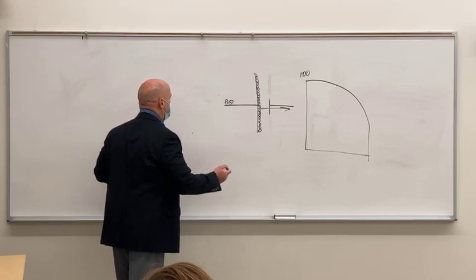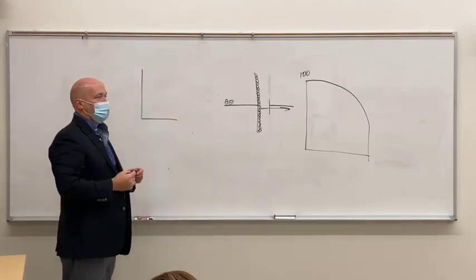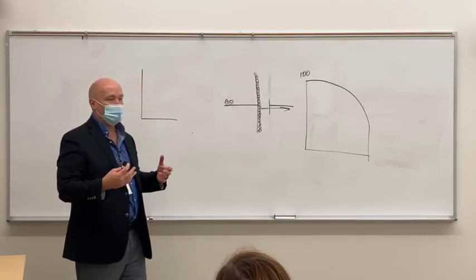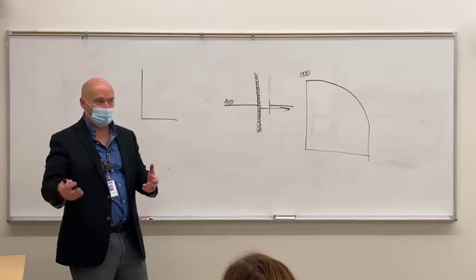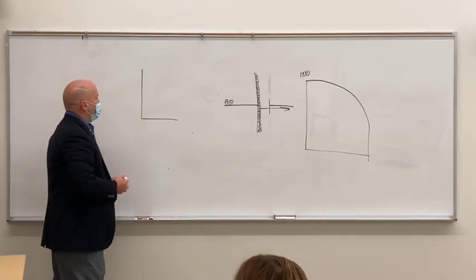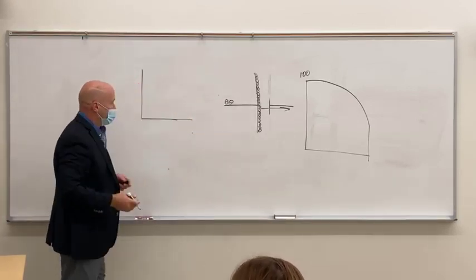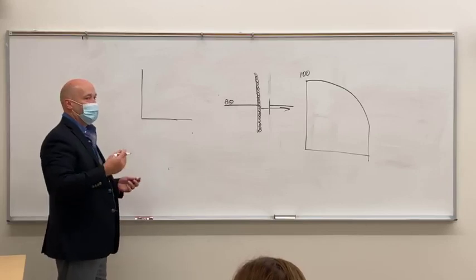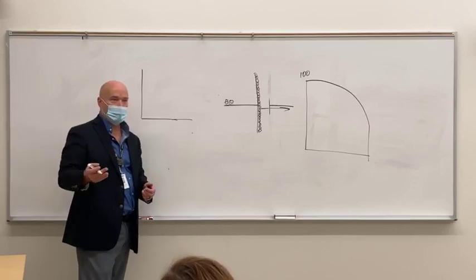What happens on a falling load generator is that they are designed, and I think they were originally implemented in departments that needed rapid exposures, very rapid exposures. But what we get in a falling load generator is, with the exposure, the machine is set to give you the highest possible mA at the outset of the exposure.